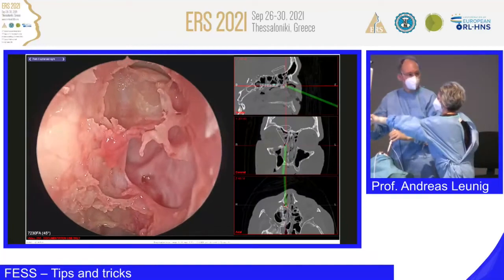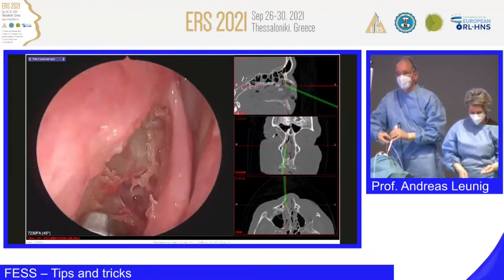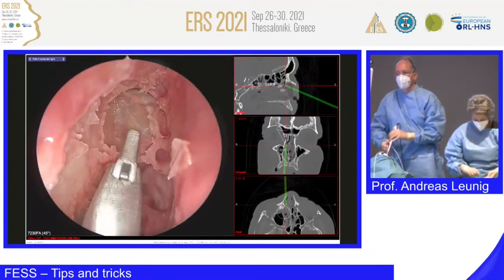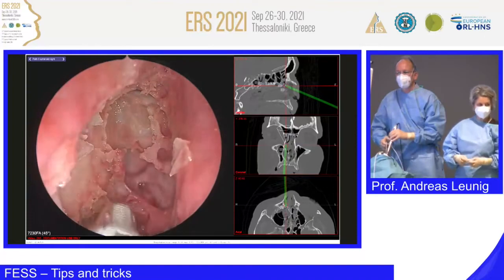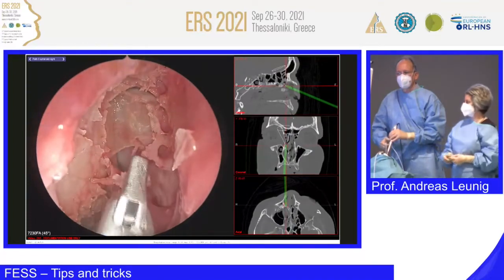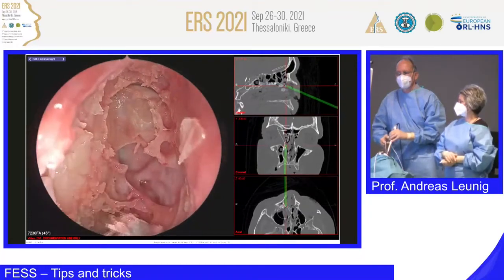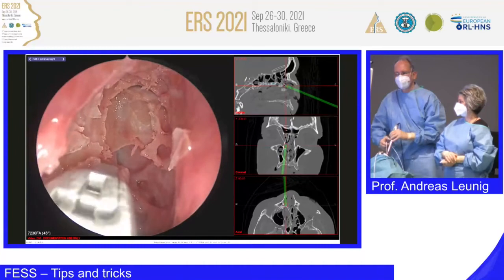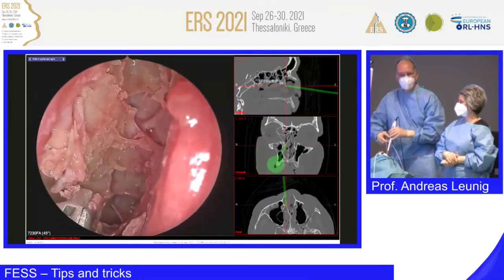Professor, could you show us where, in your opinion, it's the most dangerous spot to make damage to the orbit? Yes, to the orbit or to the anterior skull base? Both. To the orbit, I would say it's around here, a very thin part. It's getting a little bit harder lower down.